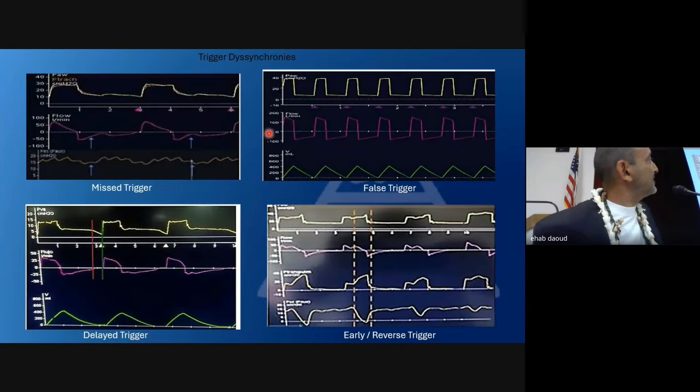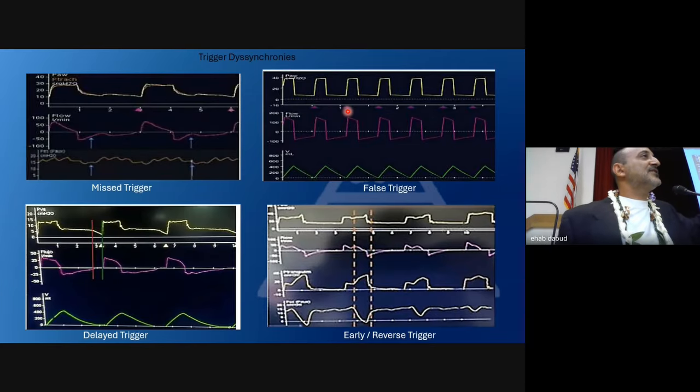How about that? This patient, the ventilator all of a sudden is breathing 60, 70 times per minute. Then you look at the patient, he's paralyzed or sedated. He can't be breathing 60. Yeah, that's probably false trigger. The ventilator is acting crazy. It's triggering sometimes on the heart rate. The sensors now are so sensitive, and it's lying on his chest, and it's detecting the heart rate as triggering the vent, or there's some water or something like that. So we have to figure this out.